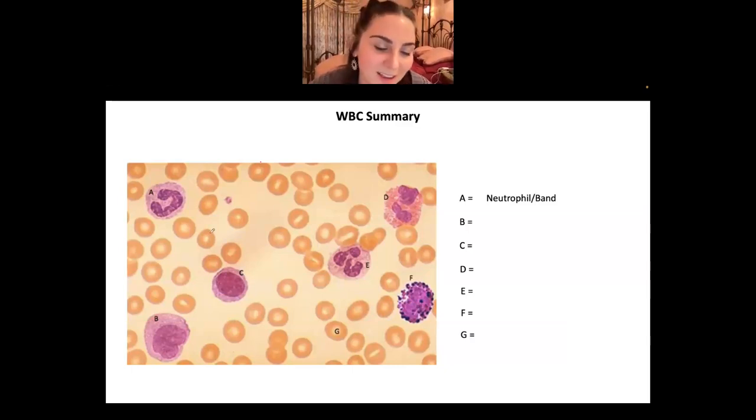Awesome. I was hoping that at least one of you would get got and say macrophage, but none of you got got. I'm very proud. Yes, this is a monocyte. It's the exact same cell. Macrophage is the exact same cell, but macrophages are not in your peripheral blood smear. Macrophages are only macrophages as soon as this leaves and goes to the tissues.